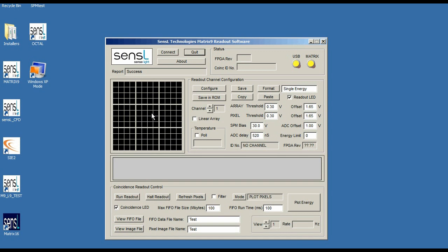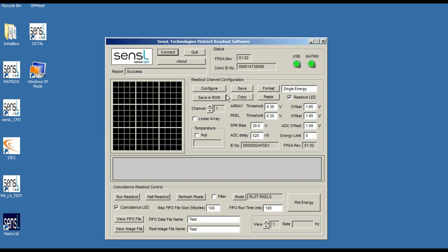We've shown you how by running the readout here, by connecting to the module first. We have to connect to it and make the USB and the Matrix lights go green.